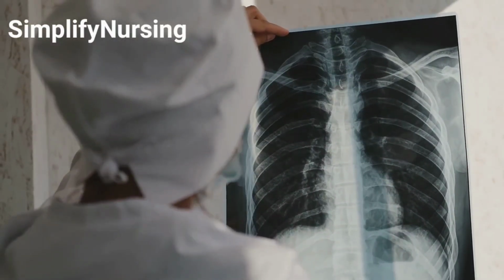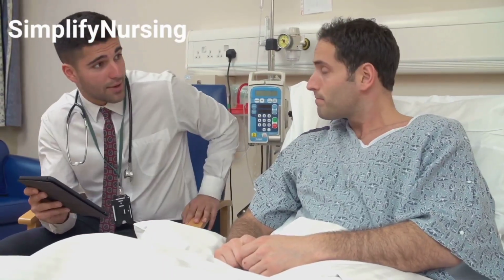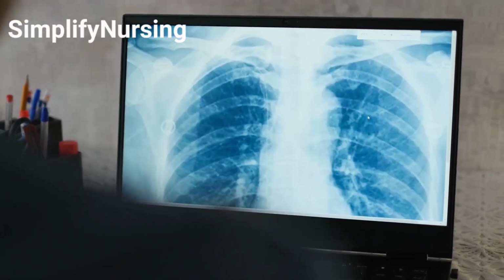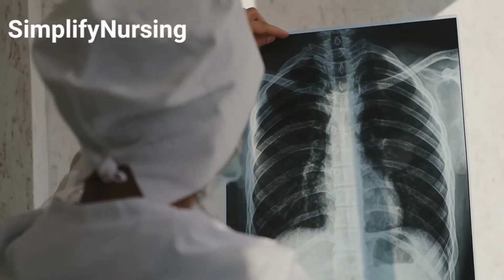Lastly, let's cover patient education. It's essential to explain the purpose of the chest tube and what the patient can expect. Also, instruct the patient to report any sudden changes in breathing or increased pain. This helps ensure they understand the importance of monitoring their own condition.